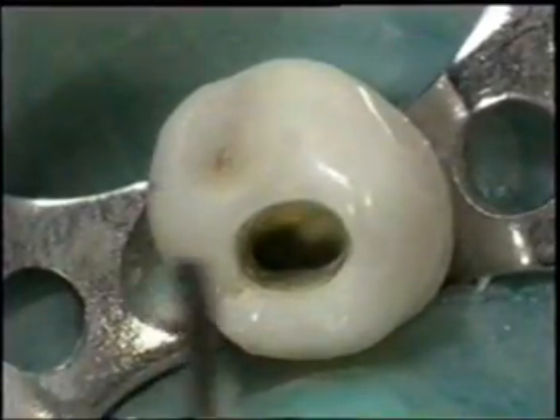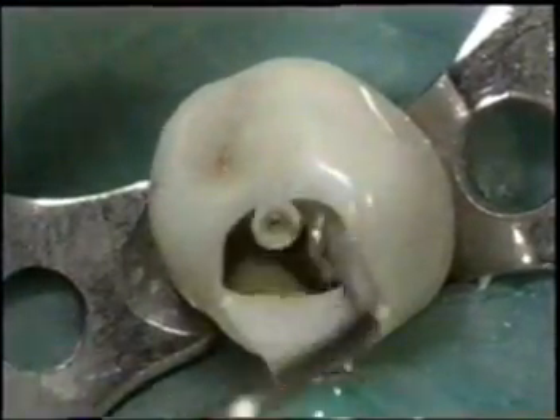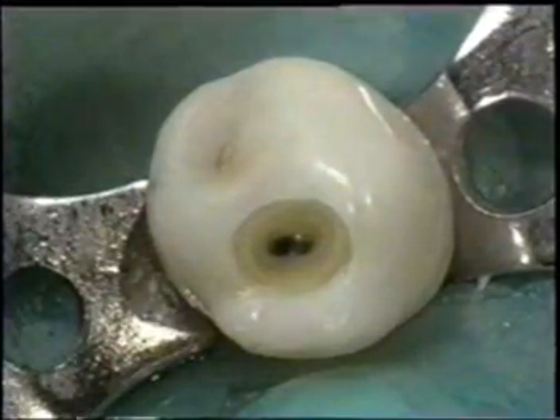Use a Gates Glidden Burr to finish preparation of the canal orifice and the access cavity. After irrigation, this is the final access shape for the mandibular first premolar.